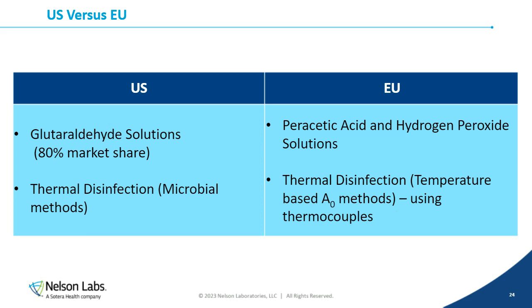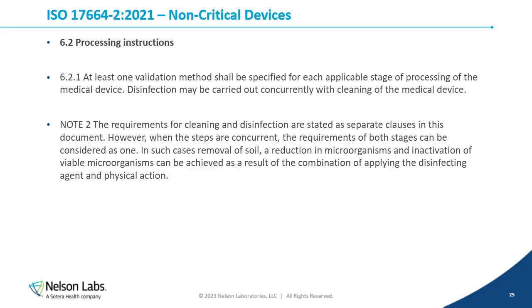So one thing I do want to mention is ISO 17664-2 was updated in 2021, and it clarified some requirements for non-critical devices. So it states that at least one validation method shall be specified for each applicable stage of processing of the medical device.